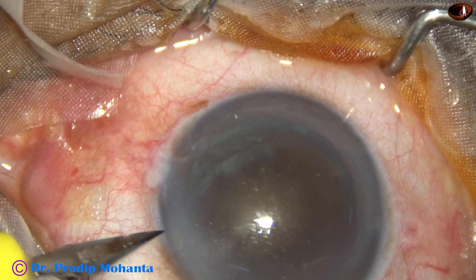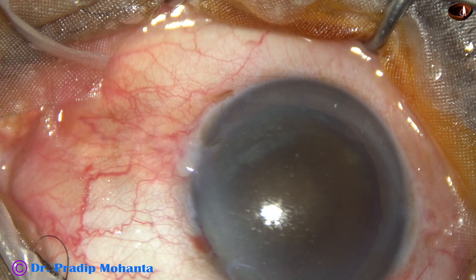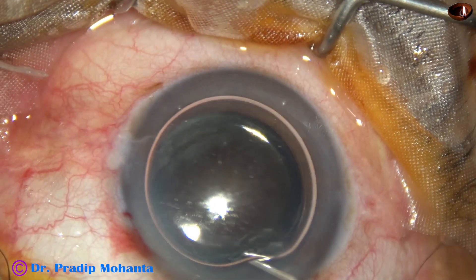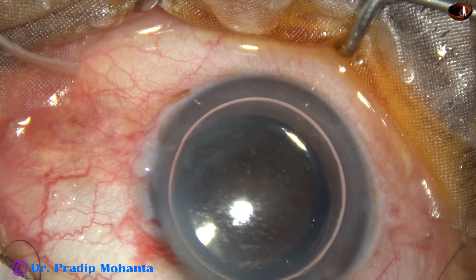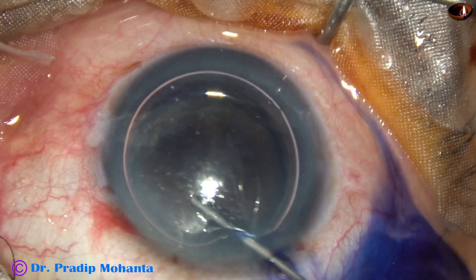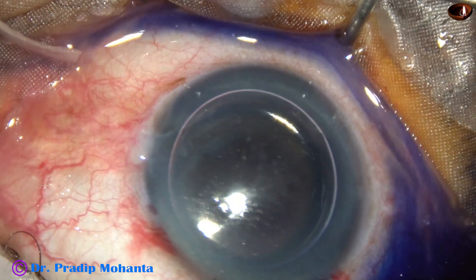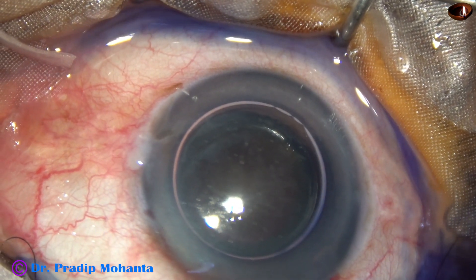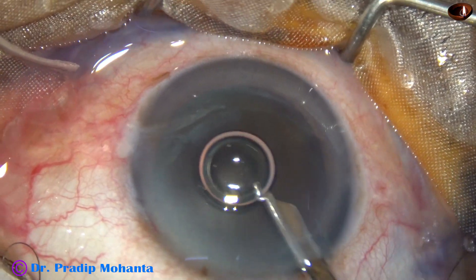By this time the main incision has been made and this is a side port on the left side of the main incision. An air bubble is injected into the anterior chamber. Beneath this air bubble, trypan blue dye is applied over the anterior capsule to get some contrast during capsulorhexis. The dye is washed out using BSS and a Simcoe cannula.